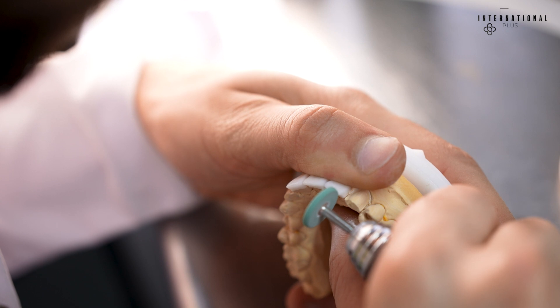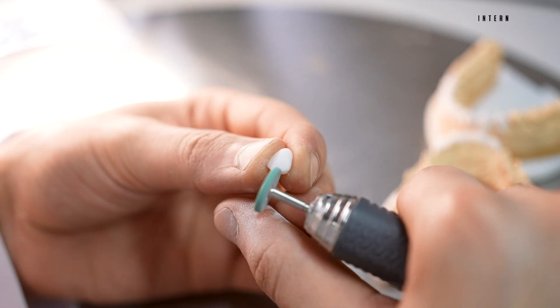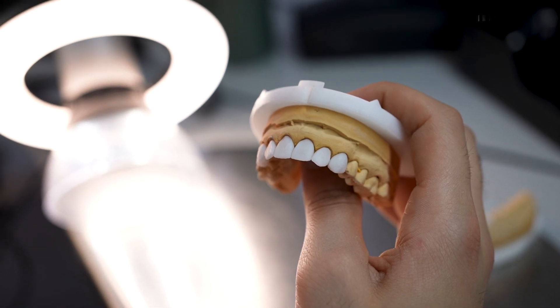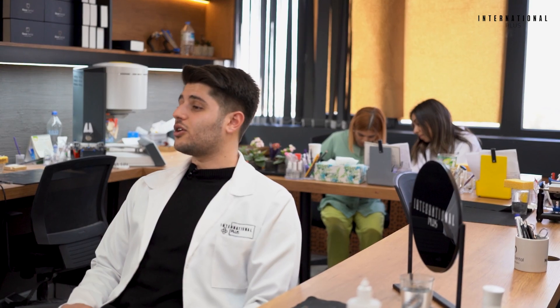After the second layer is finished, the crowns go back to the sintering oven again in order to get ready for the polishing session. The final result will come out after 3 times baking in the oven. At the end of the day, it is worth all our tiredness that all the efforts result in the beautiful smile of our happy patients. See you in Istanbul!